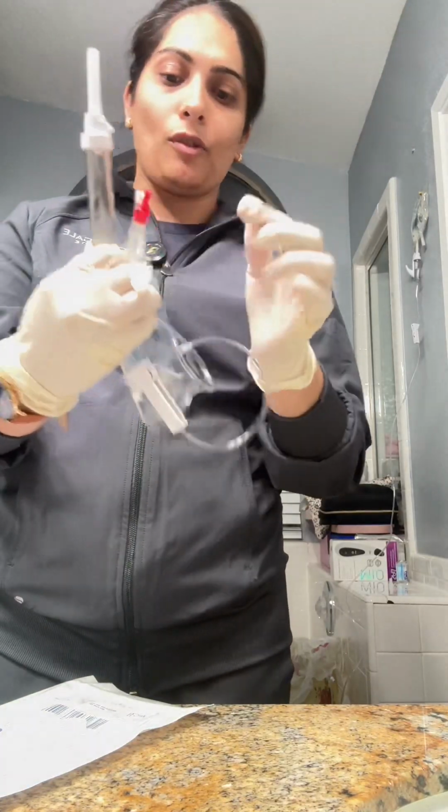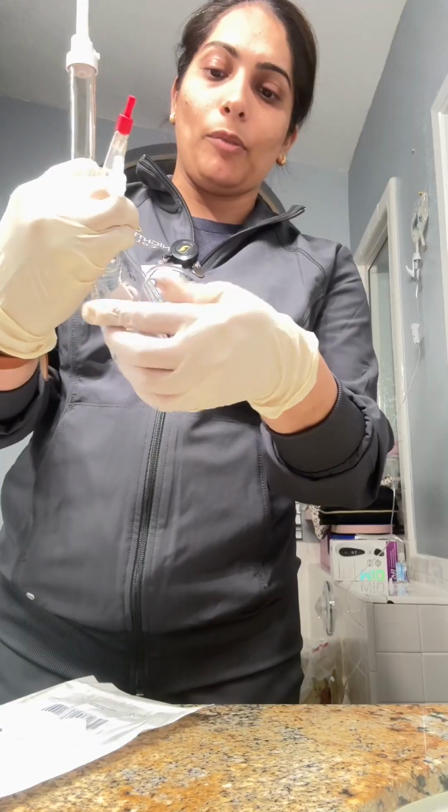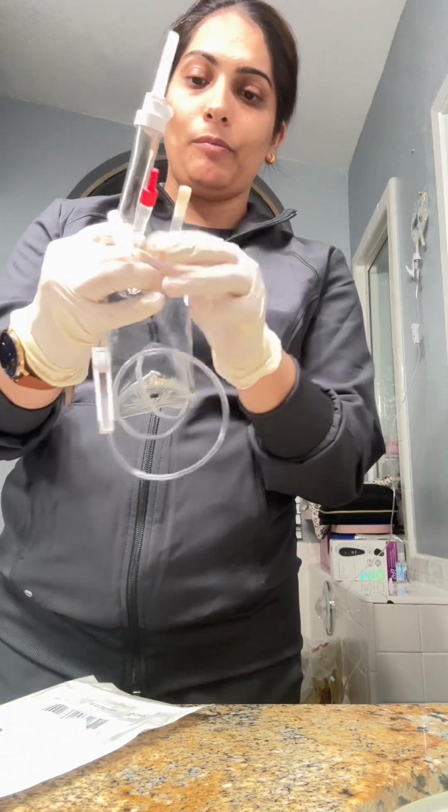Again, the spike, drip chamber, roller clamp, and then the adapter.